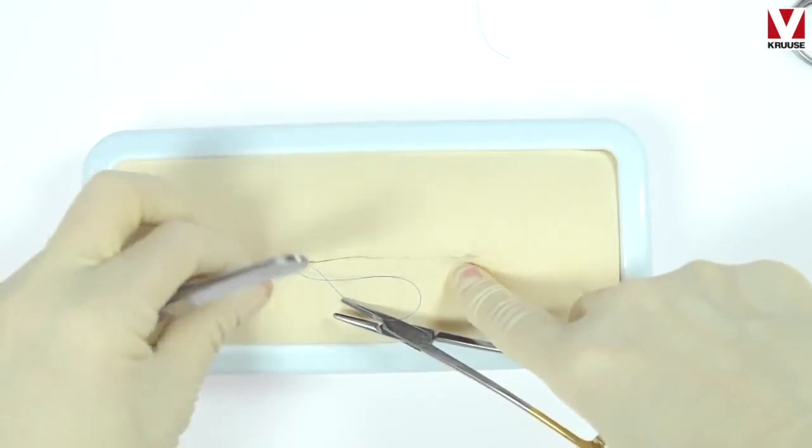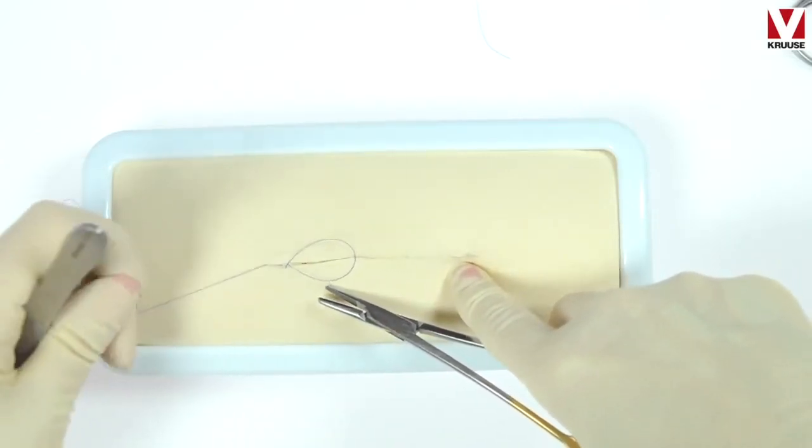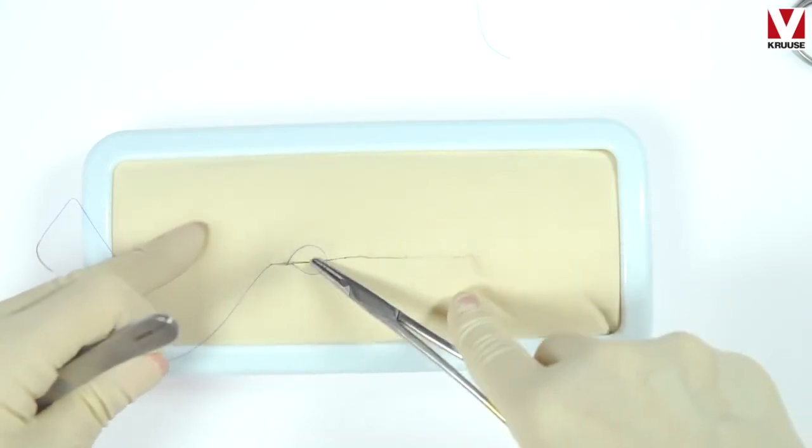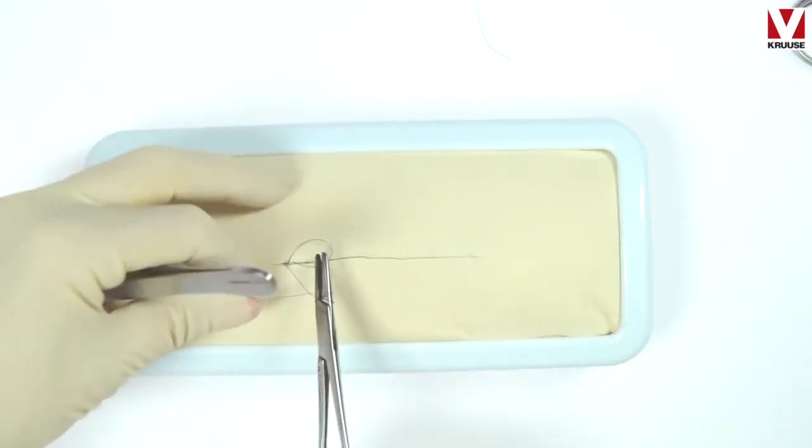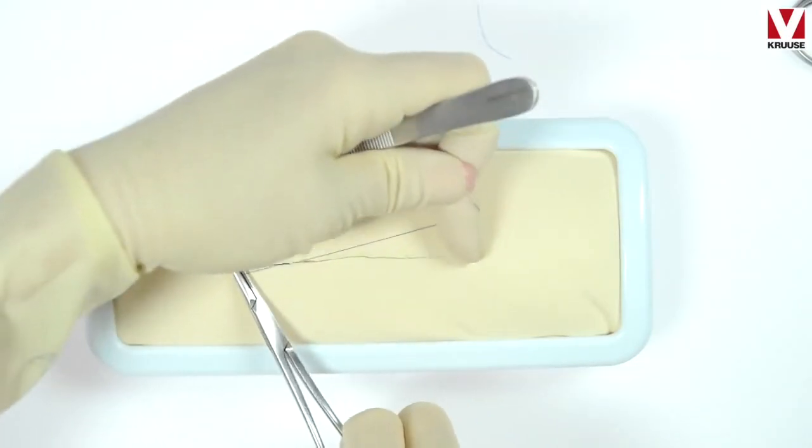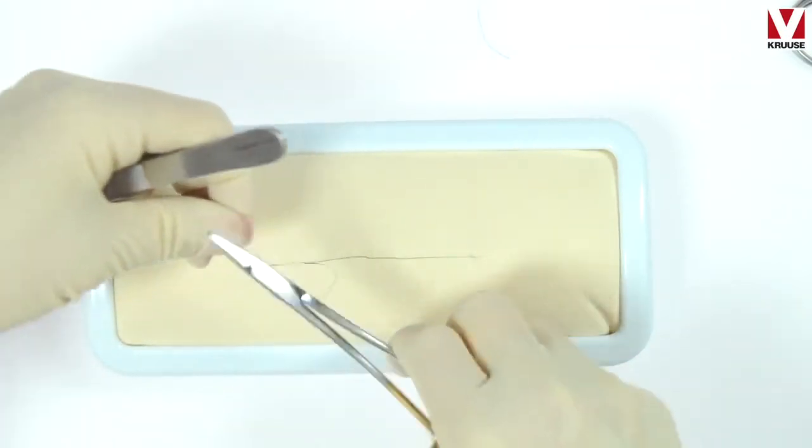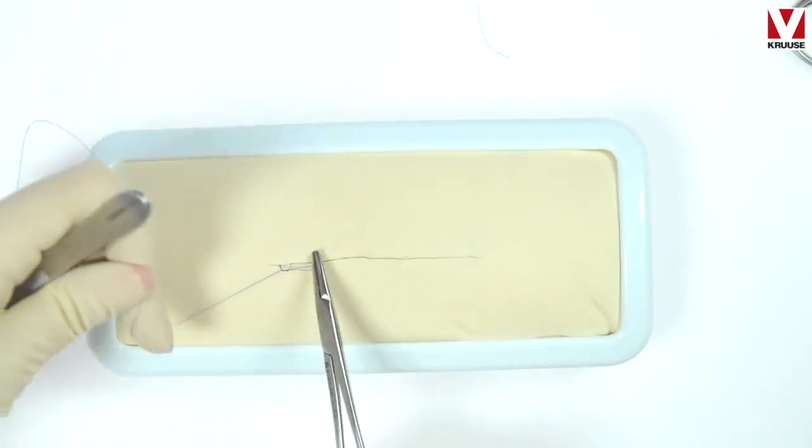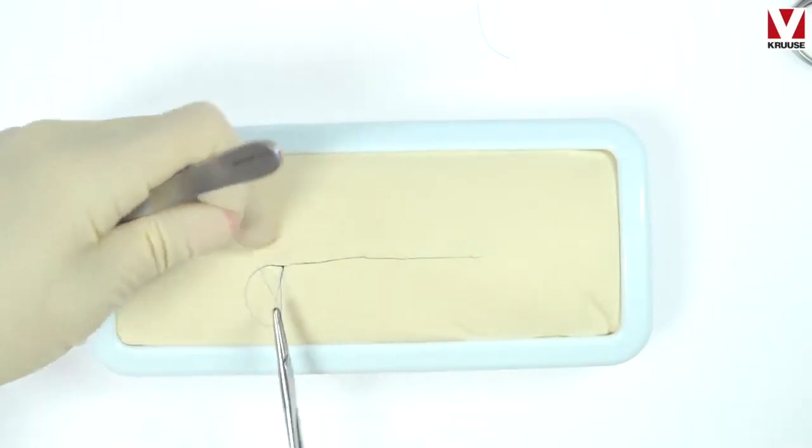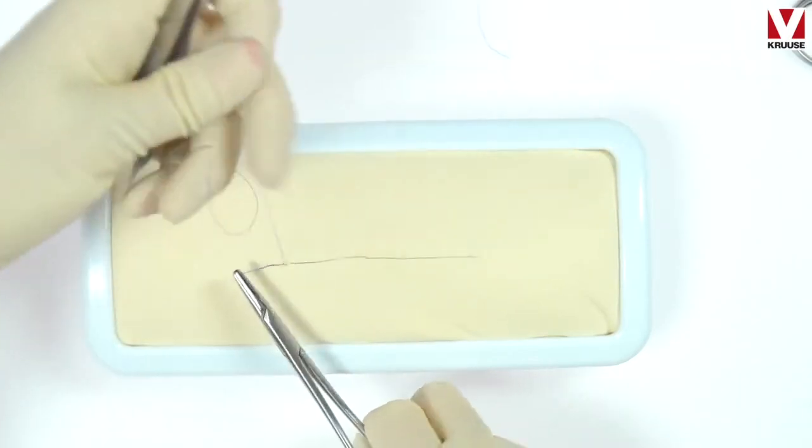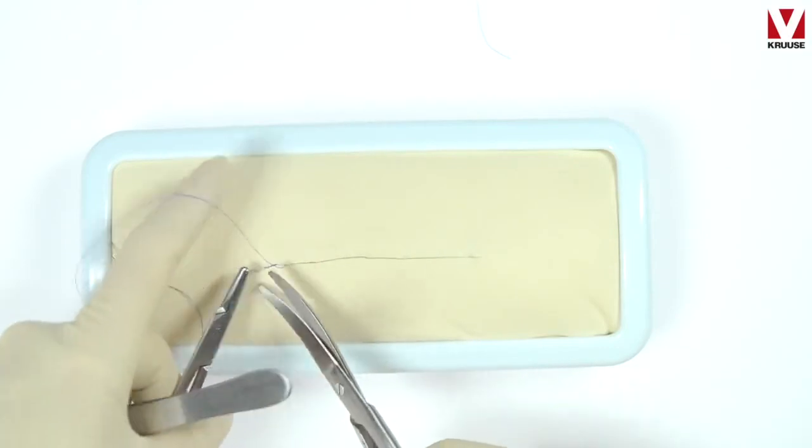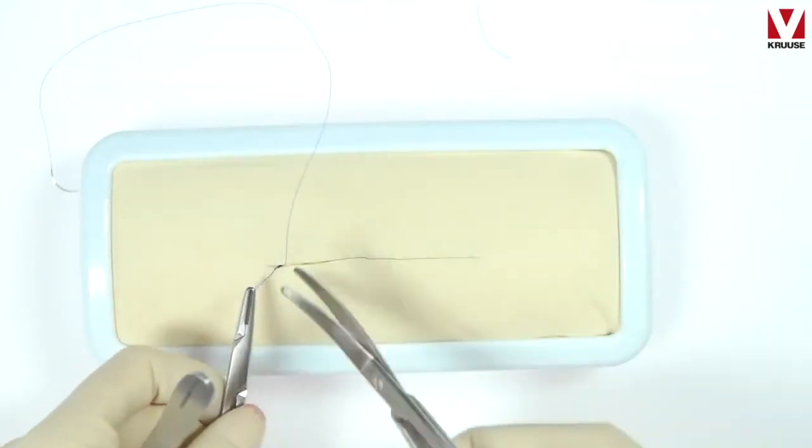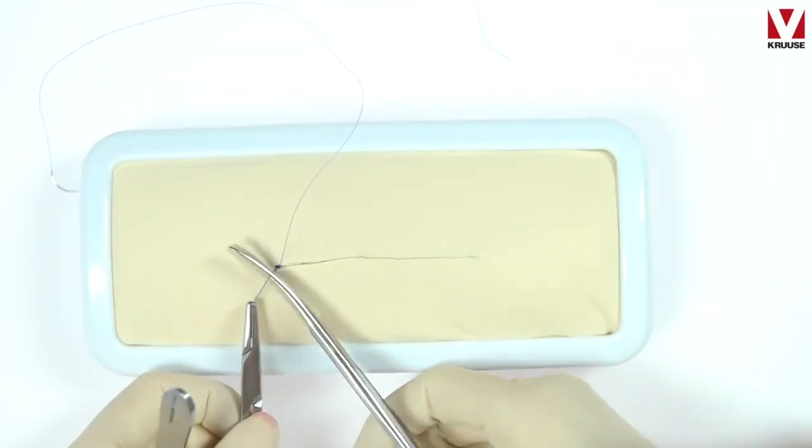And then I make a loop with the suture. This loop I will use to tighten my continuous pattern. And now I am allowed to grab the suture with the needle holder because I will not use this piece of suture. I will cut it away. So I cut but only the loop, not the rest of the suture with the needle. Cut the loop off with short suturing end.